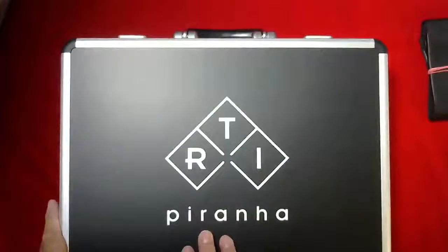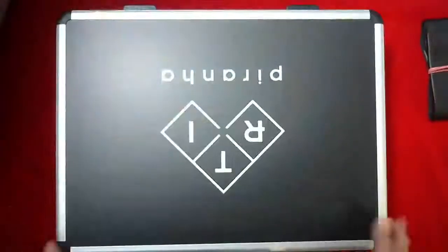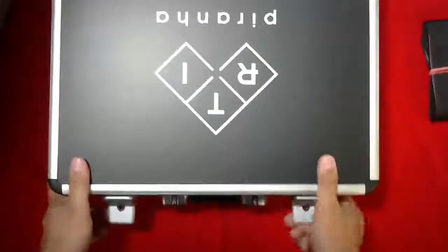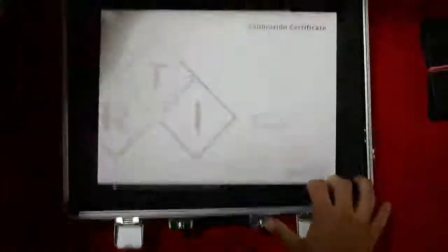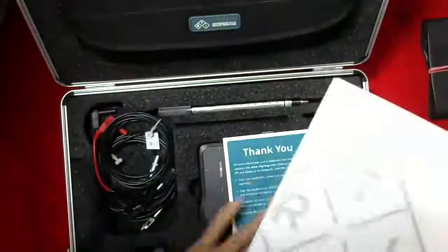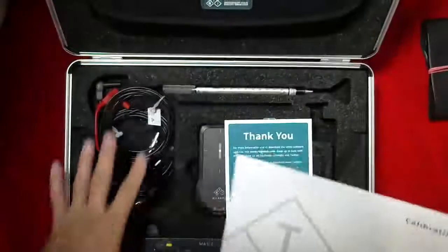You'll see RTI Piranha — this is the meter. This is the part that goes up when you're opening it. It's a two-clasp quick open. A nice presentation for the case — everything has its own spot.